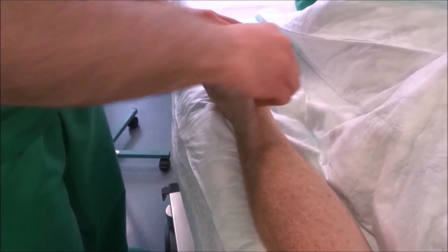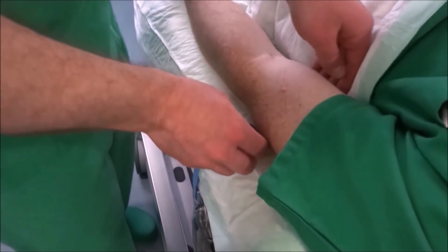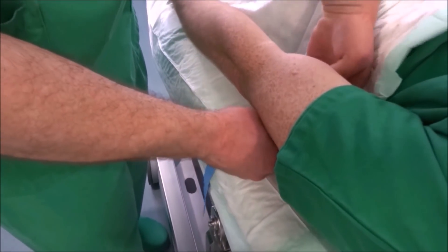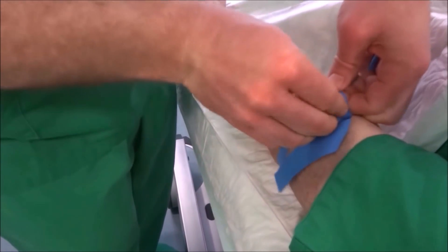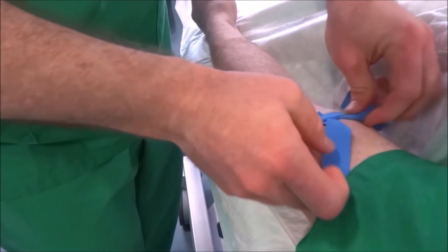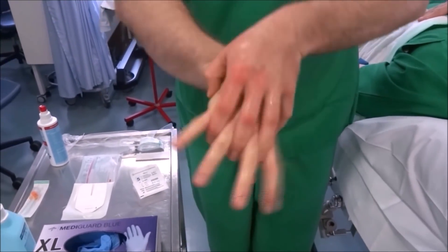We respect the exposure time of the antiseptic and make sure not to touch the puncture area again. We put the tourniquet on again. We perform a hand disinfection and pull the gloves on.